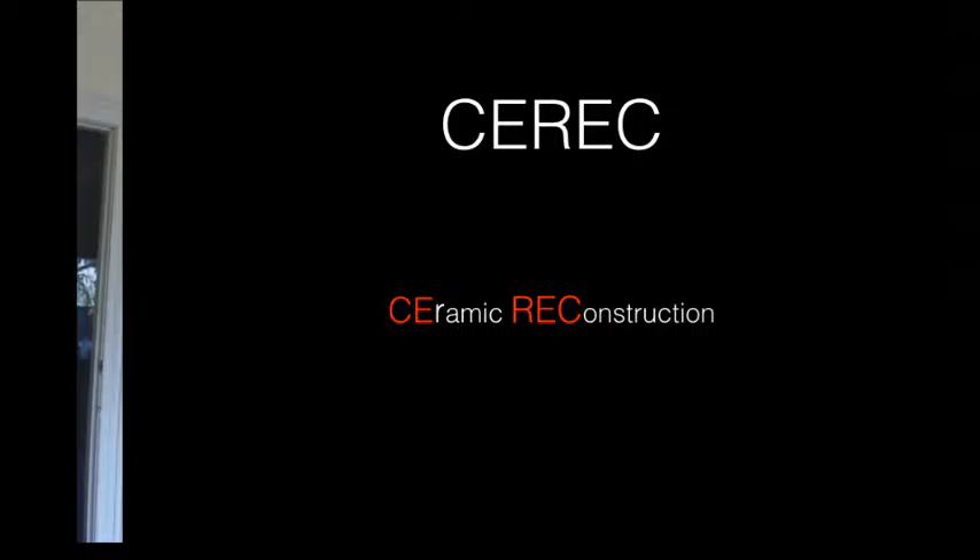What is CEREC used for? It's used mainly to restore a tooth that might need a crown or an inlay. So if you've been recommended or you're in need of a crown or an inlay, CEREC may be what you're looking for.